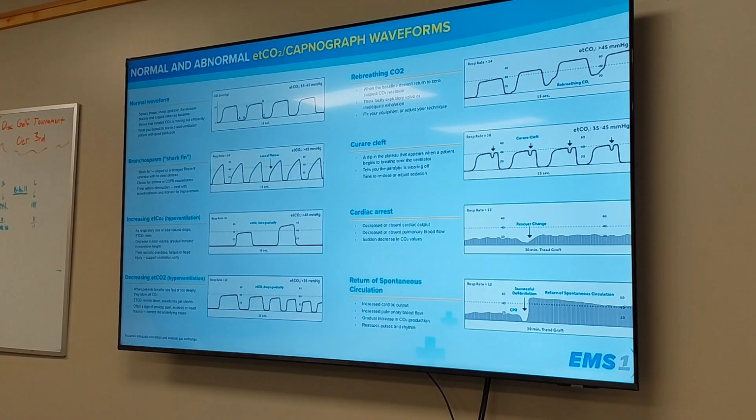When you're alive and you breathe out, you're actively breathing out, whereas they're passively breathing out. They're still perfusing, because you're doing it for them, but you're not going to have that perfect waveform that you would have if they were breathing on their own.